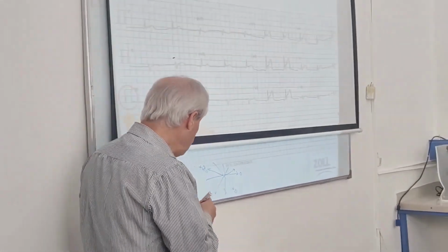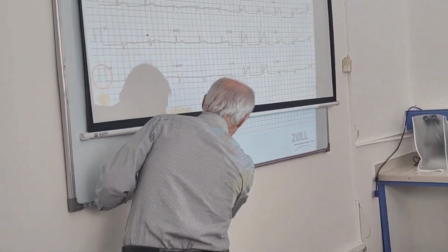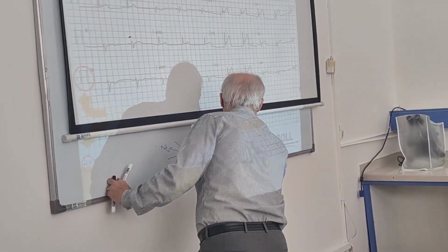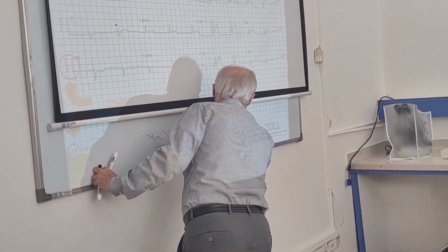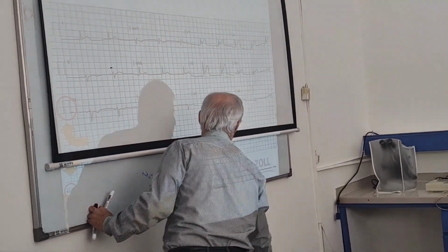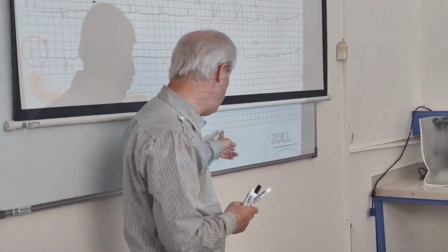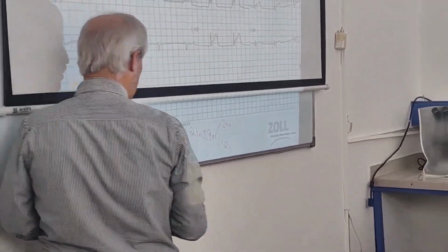So if you want to make two perpendicular lines to AVR, this is one line and this is one line. Means 210 plus minus 90: 30, 300 and 120. So you can have two perpendicular lines. 300 equals minus 60.